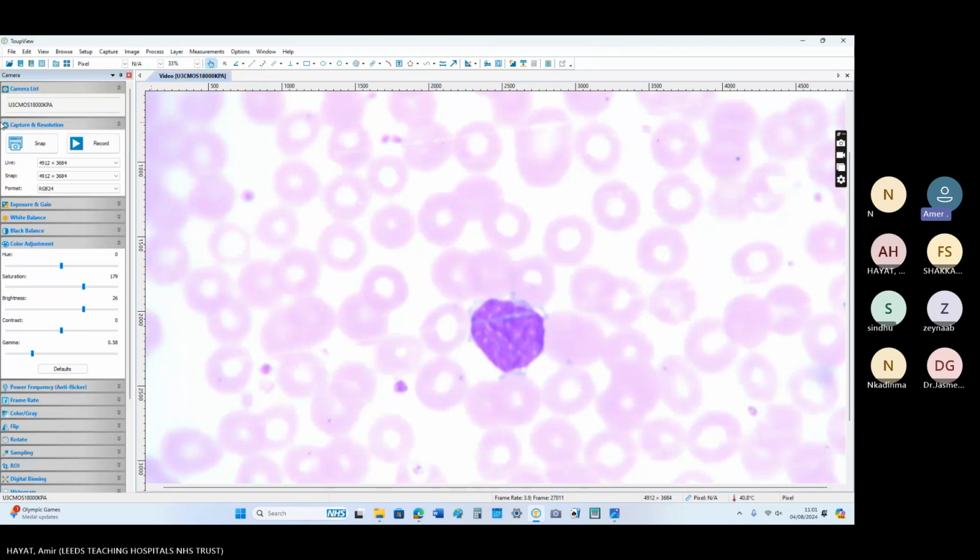What about this cell? Again, it's a large size cell. Even in the chromatin, there are areas of euchromatin and heterochromatin, some lighter and some darker areas. Actually, they are not the nuclei. They are the nuclear pattern of these atypical lymphoid cells. I might be wrong, but I think it's. Do you think these nuclei are cerebriform? I want to make them, but I'm not convinced.